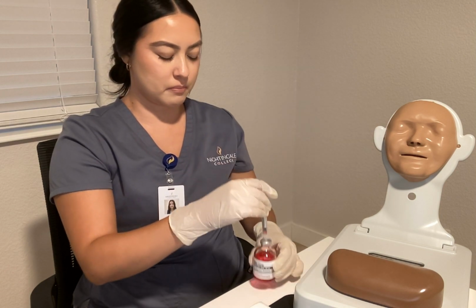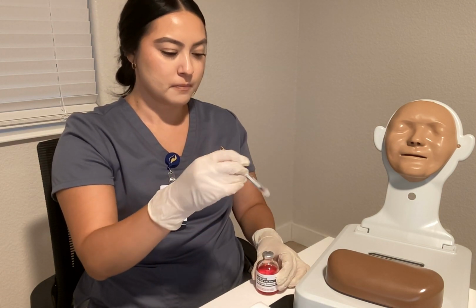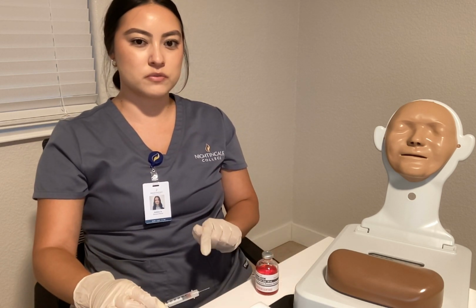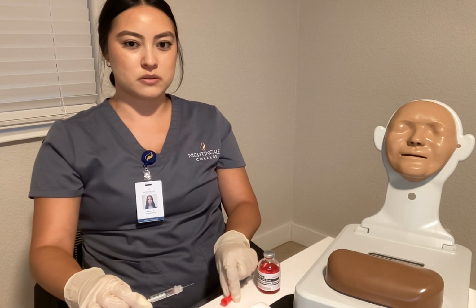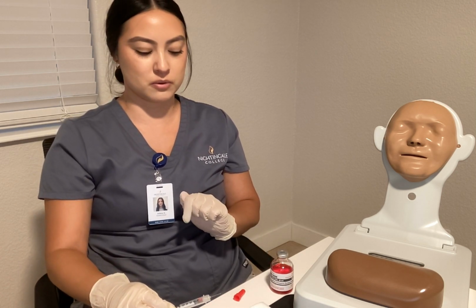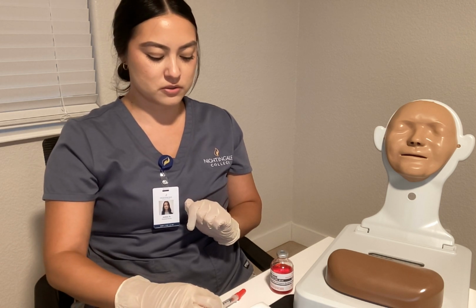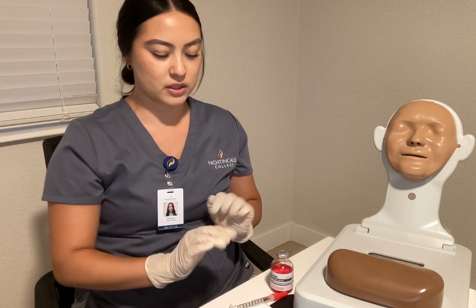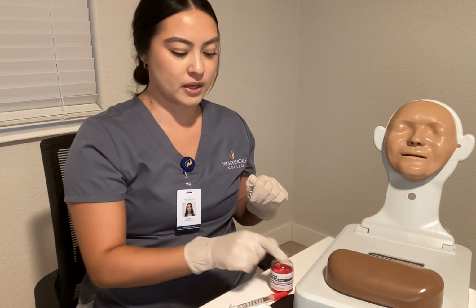So I'm going to flip out, pick up, and I'm not going to recap, but I'm just going to move this so I can show you. But I would not do this and keep my needle out like this if I was in a real patient situation. I'm just going to not cap it, but I'm just going to do the swoop method, and we're just going to leave that there. I'm not going to touch it until I am ready.